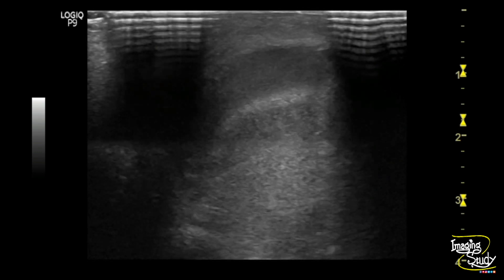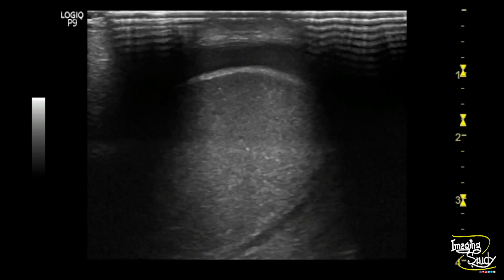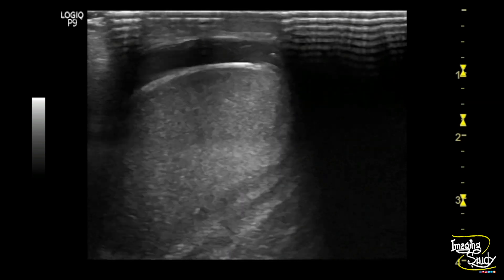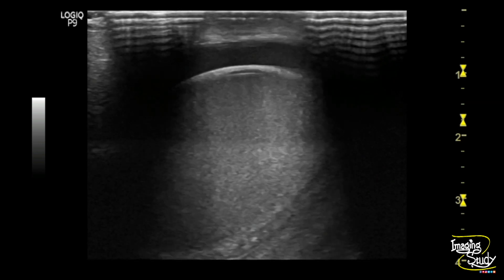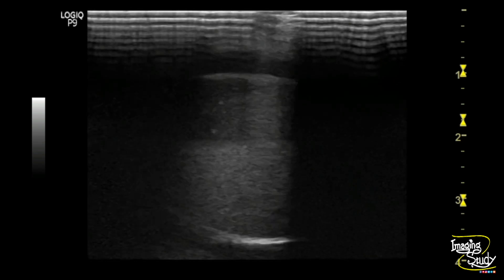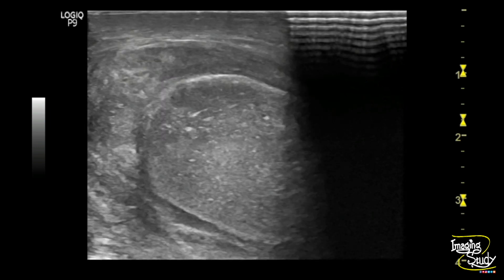Now, is it epididymoorchitis or testicular torsion? To confirm, we will use color Doppler ultrasound.